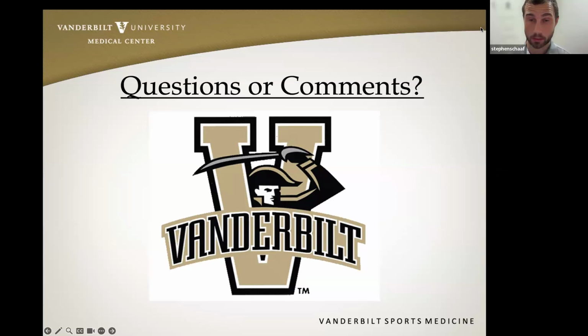Yeah, thanks, Brendan. I appreciate all those comments. One thing I would piggyback on is the plantaris tears. Those can actually be fairly tough. The critical part for scanning those, if you're having difficulty seeing that versus just the medial gastrocnemius injury, is really the short axis scan, especially going from proximal to distal.